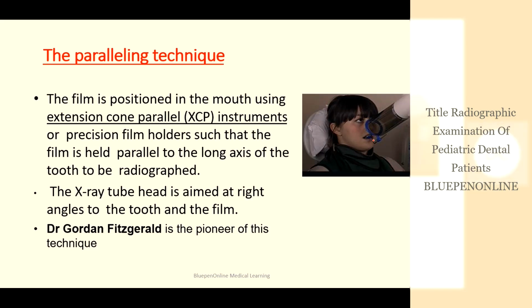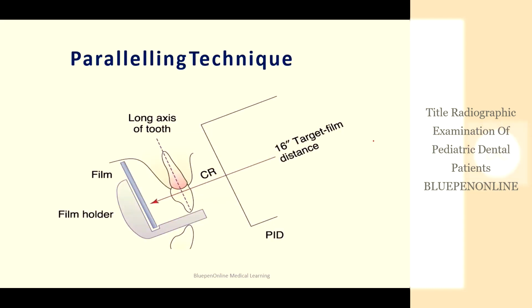This was introduced by Dr. Gordon Fitzgerald. In case of the paralleling technique, as I said, the film will be placed parallel to the long axis of the tooth, and the X-ray coming from the PID will be perpendicular to both the film as well as the long axis of the tooth, and hence the name paralleling technique.